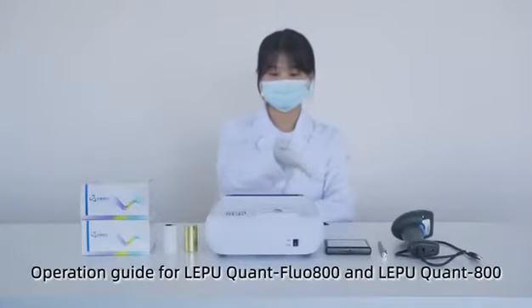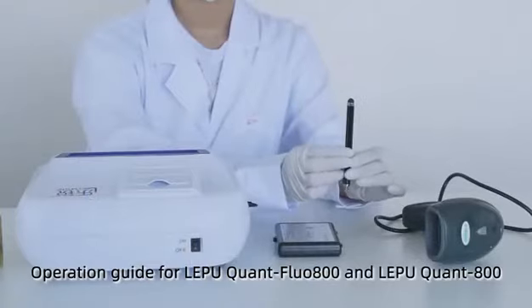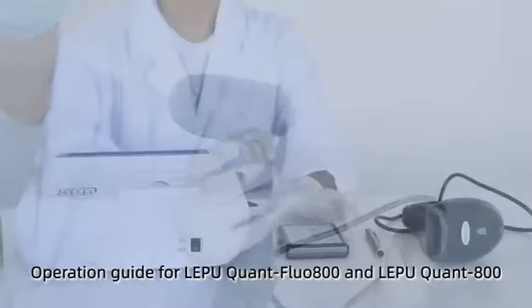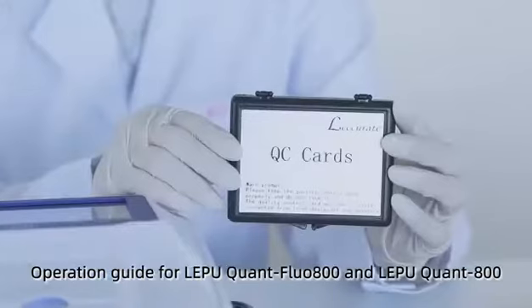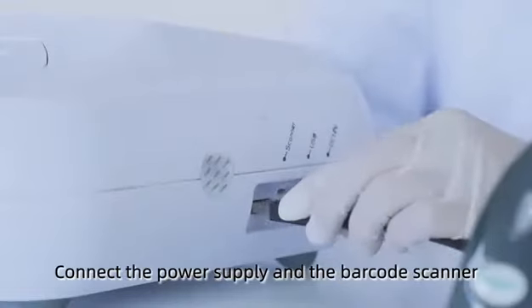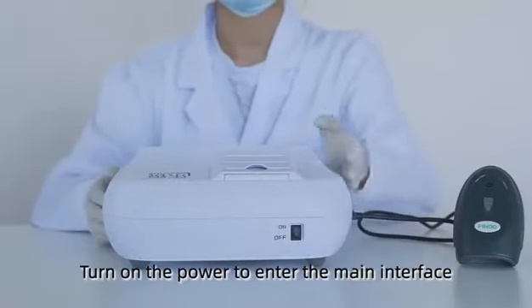Operation guide for Le Pu Quant Flow 800 and Le Pu Quant 800. Connect a power supply and a barcode scanner. Turn on the power to enter the main interface.